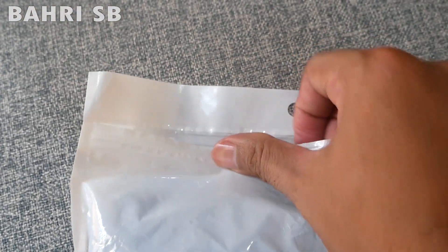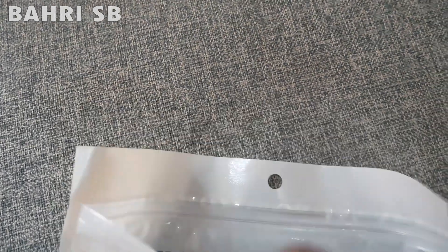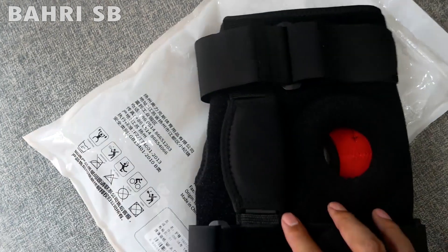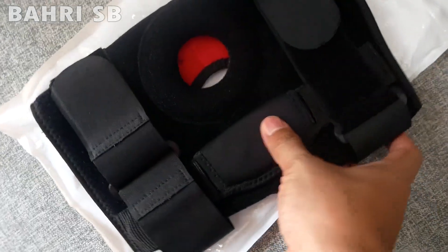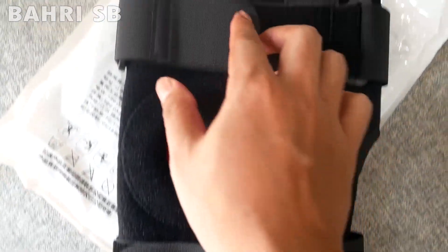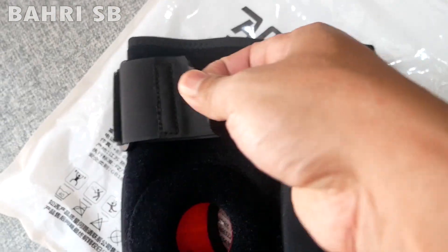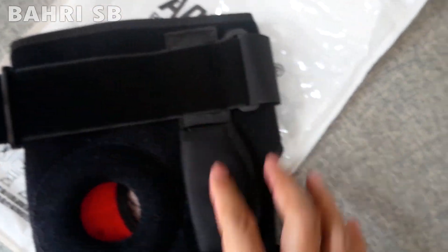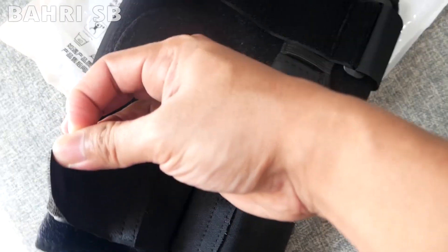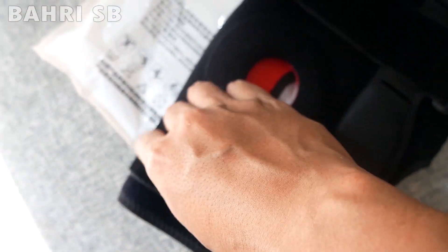Yuk langsung aja kita lihat dalamnya. Ini dia barangnya, satu buah knee support dari Owlikes. Knee support ini bukan hanya knee support biasa, karena dilengkapi dengan besi aluminium atau plate, agar lutut tidak banyak pergerakan dan pemulihan lutut jadi lebih maksimal.